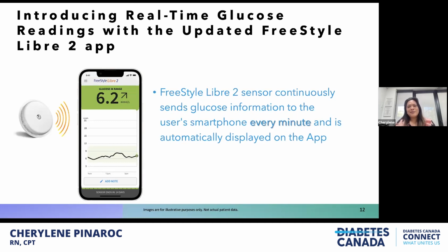I don't want to say there's no more scanning completely, because we do have to scan whenever we start a new session. But sometimes there might be a lack of communication, or missed data. You can always scan and it will fill in the last 8 hours of your data. So if it was less than 8 hours, and there was miscommunication or you left your phone somewhere, you can fill in that data to get all your readings as you wish.